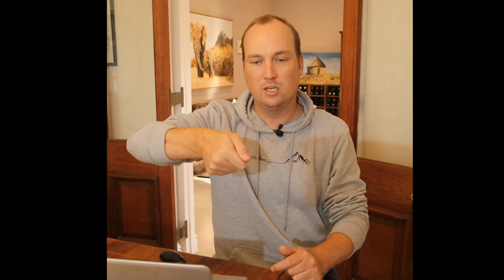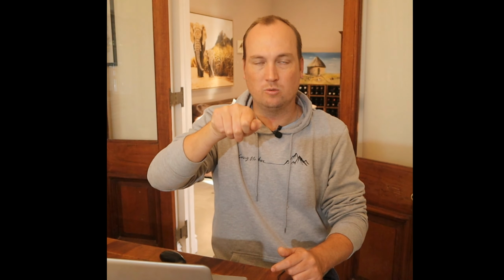You don't remove the scalpel. At that point, you turn the scalpel into a vertical position again. You've made a horizontal cut, and you rotate the scalpel so that it opens up that cut in the cricothyroid membrane.